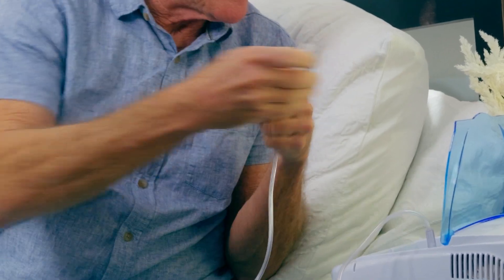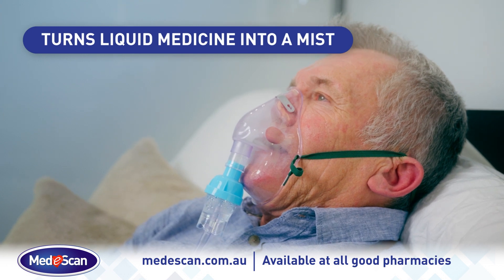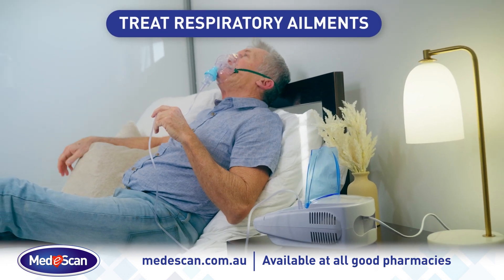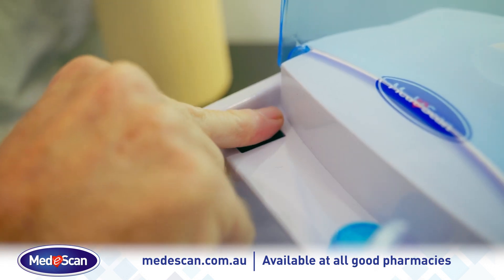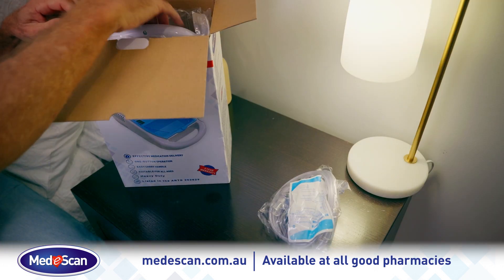Your MediScan nebuliser turns liquid medicine into a mist, creating an aerosolised medication inhaled into the lungs for the treatment of asthma, chronic obstructive pulmonary disease and other respiratory ailments. This easy to use nebuliser operates at the touch of a button, with an easy carry handle so you can take it with you anywhere.